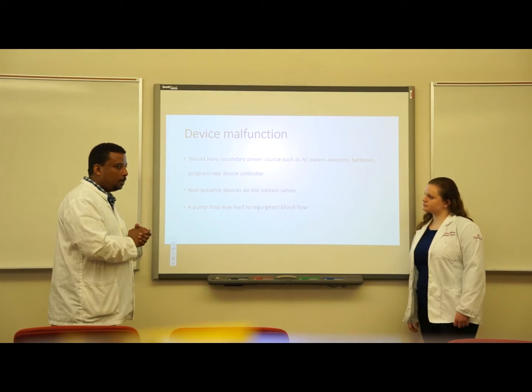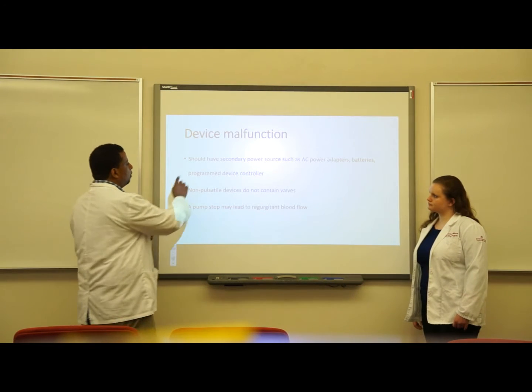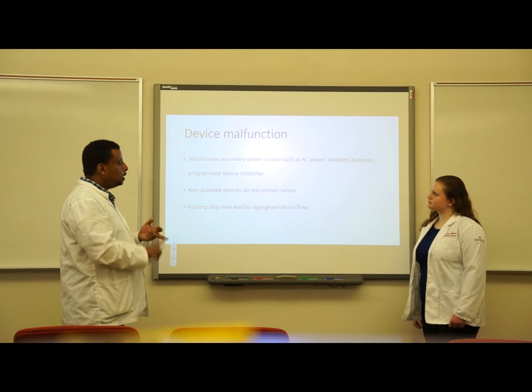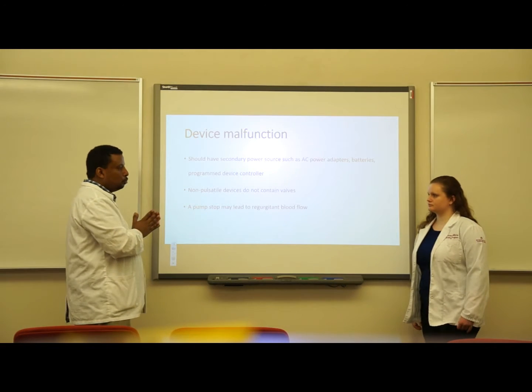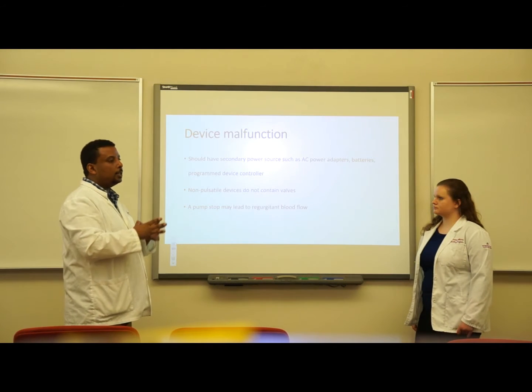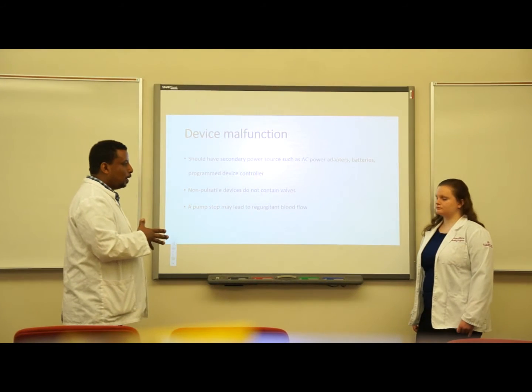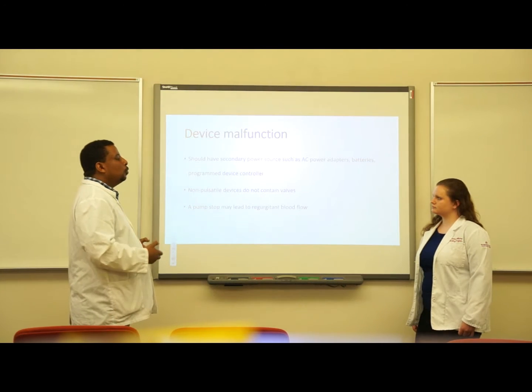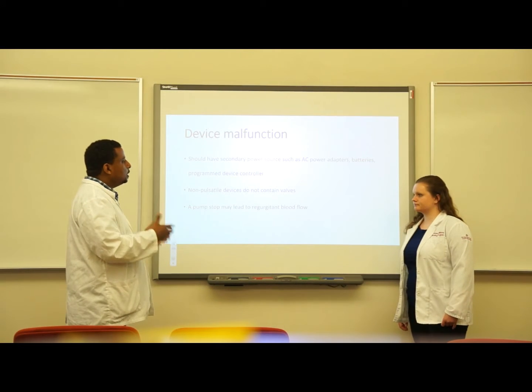To avoid any adverse effect, it's therefore important for us to have secondary power sources, such as AC power adapters, batteries, and a second programmed device controller. When I say programmed device controller, a second controller that is programmed exactly the way the one that's on the patient is programmed, so that if we have a failure on the one the patient is on, we can automatically change it and plug it in, so we have continuous blood flow.